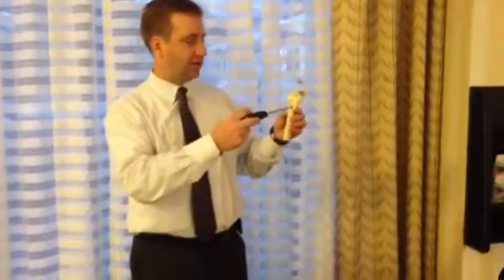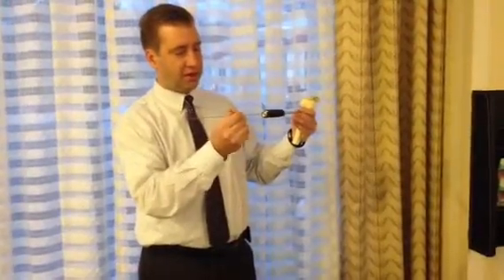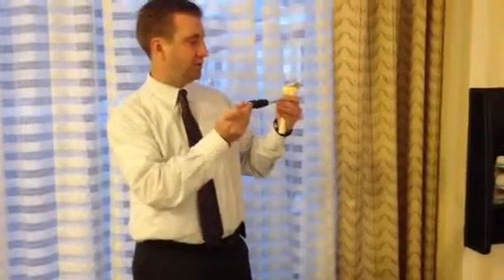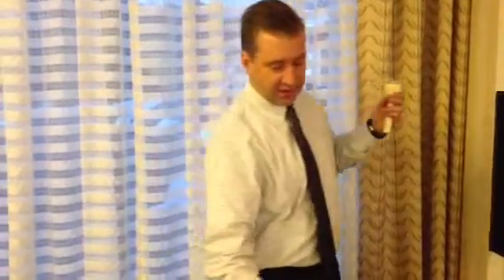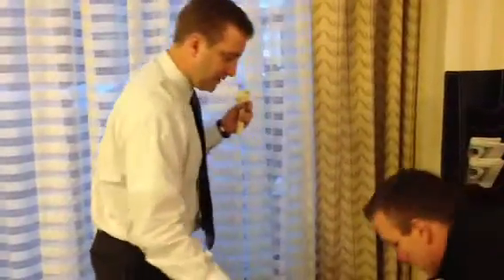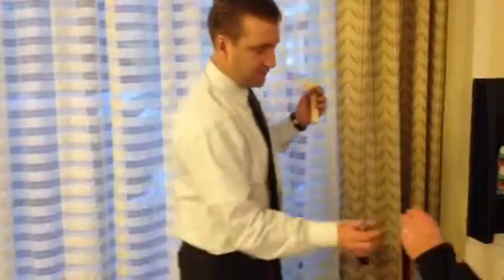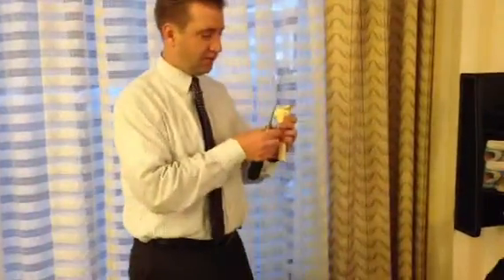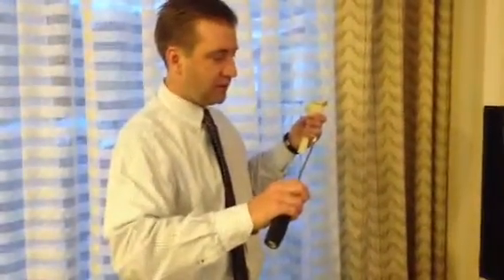We're getting back to using the tendon fork to deliver the tendon. You deliver the little sharp guide wire through the tendon fork, which spears your tendon and maintains your tension. There are some little devices that help tap it in there. What's great about that is it now acts as your guide wire to deliver your screw — the 7x12 — which just comes right over top of this guide wire.